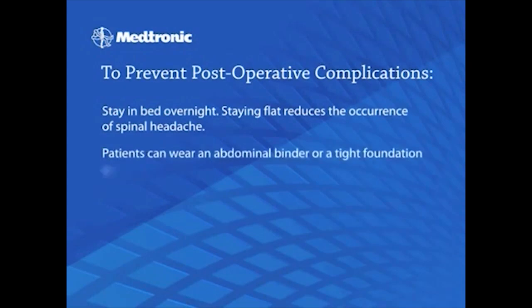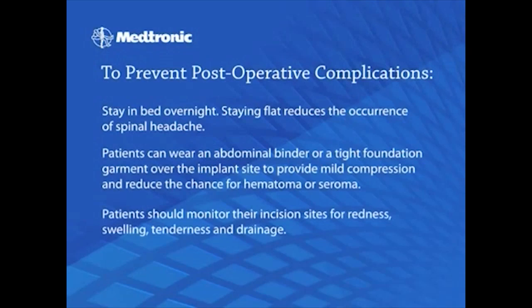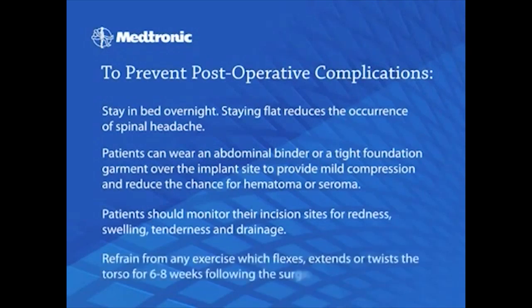Patients can wear an abdominal binder or a tight foundation garment over the implant site to provide mild compression and reduce the chance of hematoma or seroma. Patients should monitor their incision sites for redness, swelling, tenderness, or drainage, and they should refrain from any exercise which flexes, extends, or twists the torso for 6 to 8 weeks following the surgery.